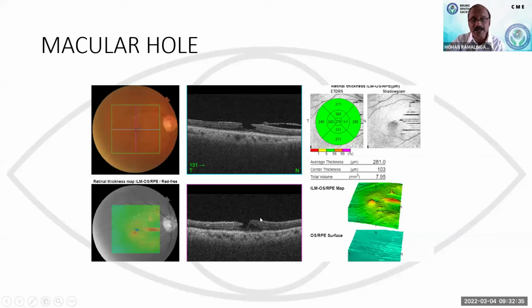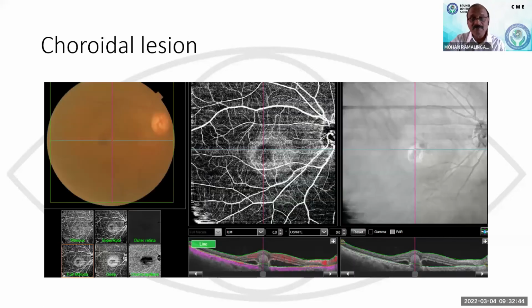Now our treatment modality is based on the OCT measurements. Early detection of retinal diseases or macular diseases can be made. And this is called OCT angiography, a non-invasive method of study of the macular circulation. The macular circulation can be assessed at the superficial layer and middle layer, and the retinal capillaries can be assessed. As you know, these retinal capillaries mirror the changes in the cerebral circulation.